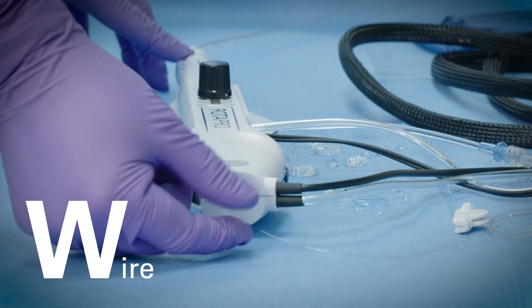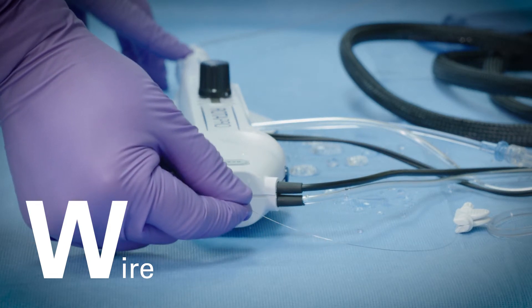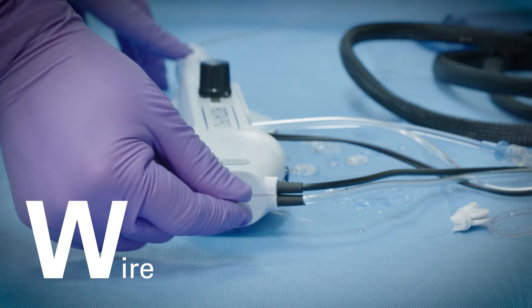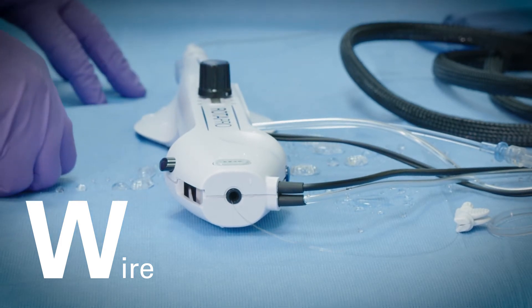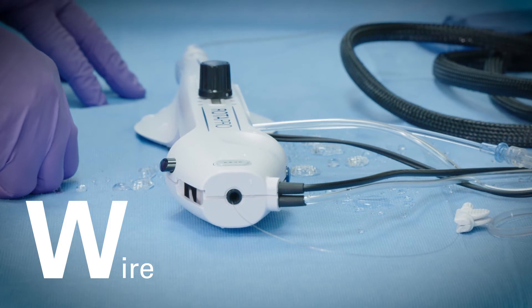W: Wire. While the Rotopro system is running, attempt to retract the guidewire at the point where it exits from the back of the advancer. During normal operation, except when the brake defeat button is pressed, the wire is securely gripped by the internal automatic brake and resists any attempts at rotation or advancement.